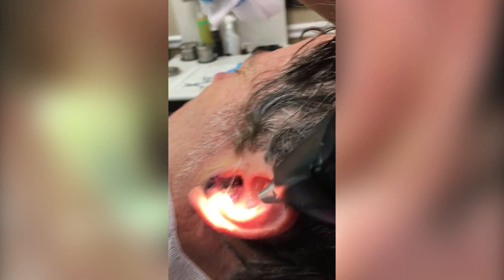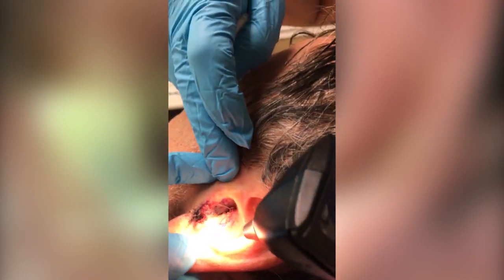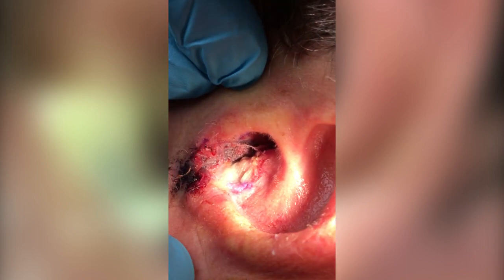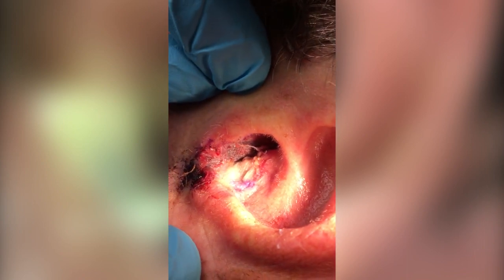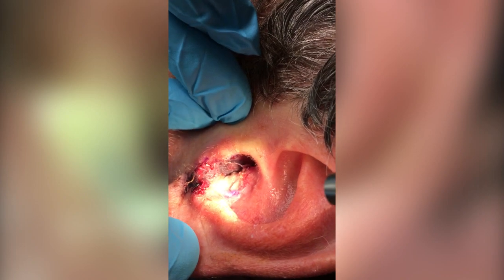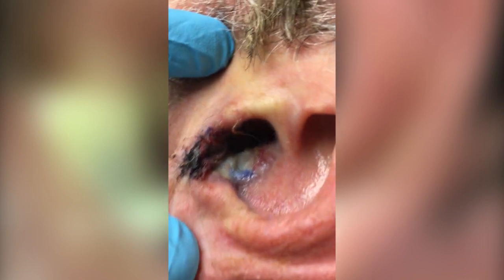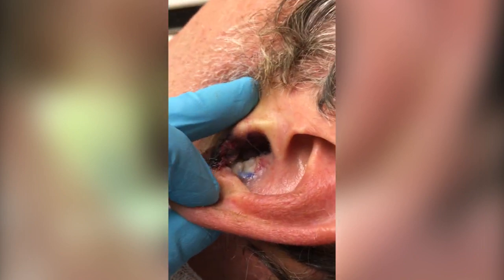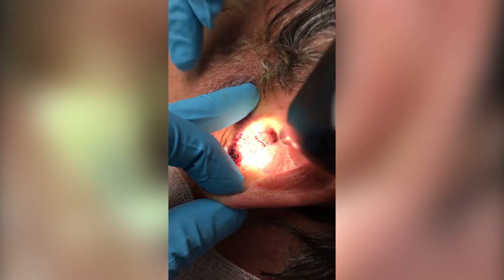Beautiful, beautiful — that has taken well! You can see, gently open, and the graft has taken right there. The graft has taken — fantastic, very happy, cannot complain. Excellent. You can take the light off for a second so I can show from here. Yeah, that's great — now you can shine a little lightly.